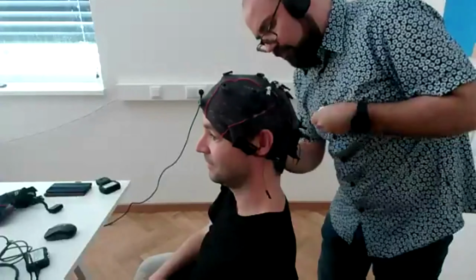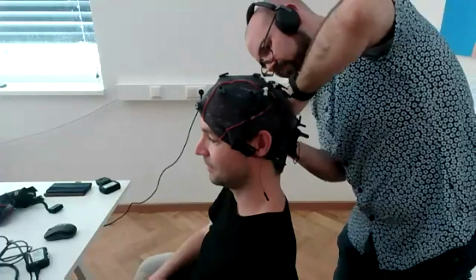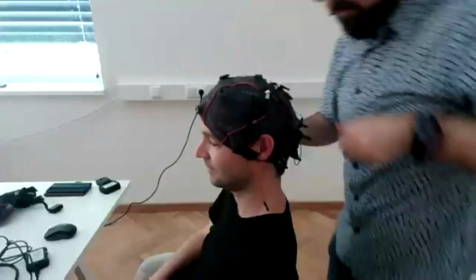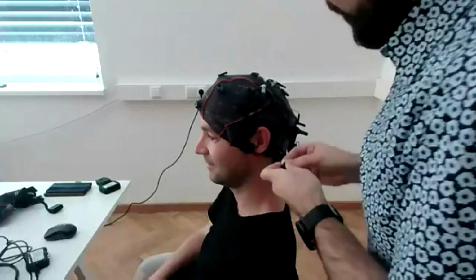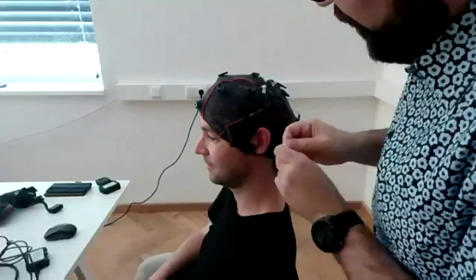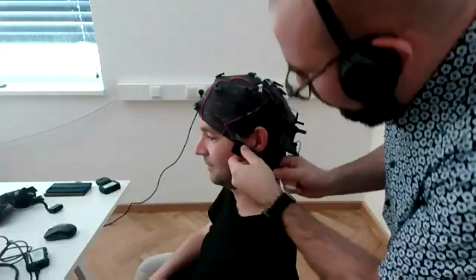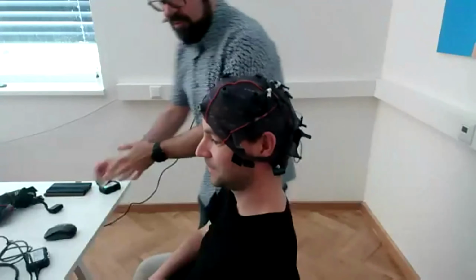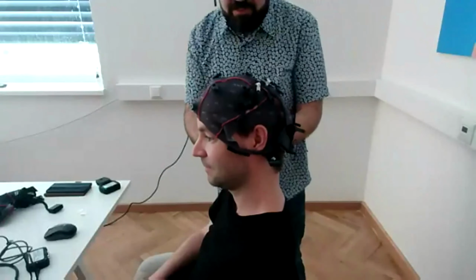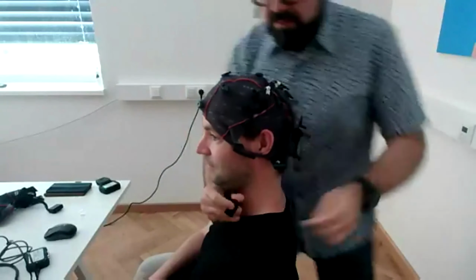Behind is here. And then just close the cap and start measuring. So I'll also use the g.Recorder so that you can see the same setup. There we go.